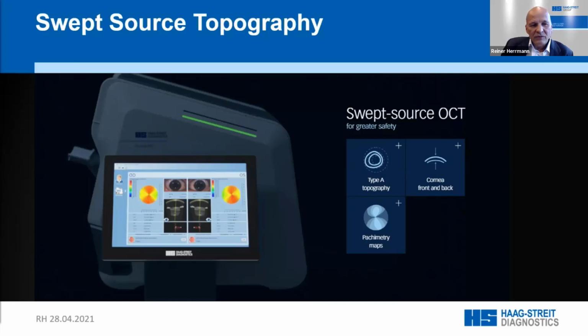So it really allows the user and the physician to screen the patient for any corneal pathology that might limit the patient's post-cataract visual potential. And that is critical, as we all know, in IOL design and planning.